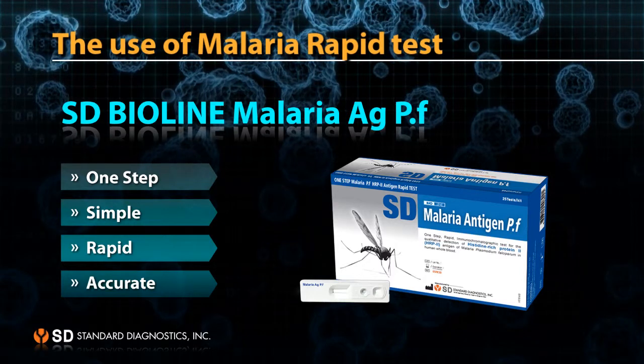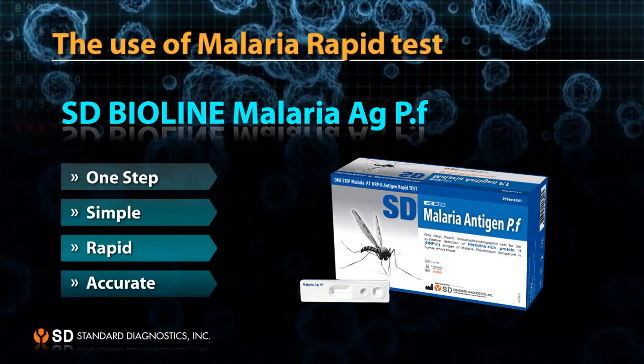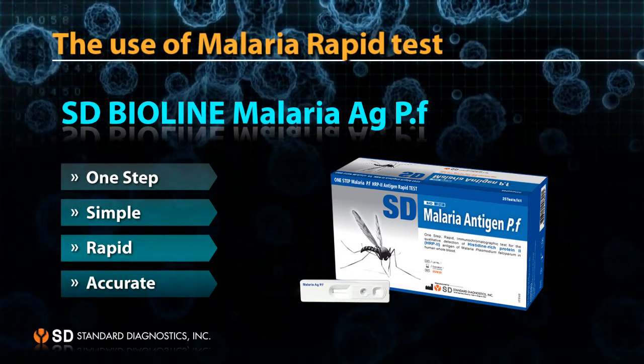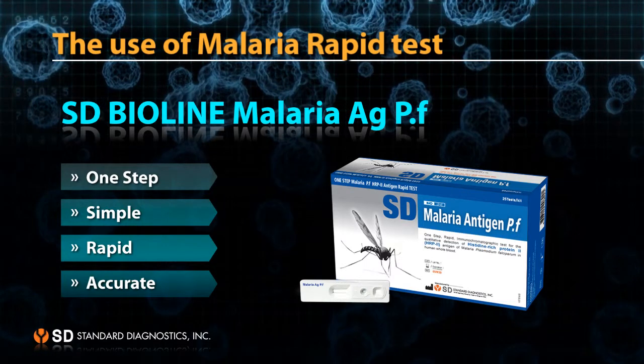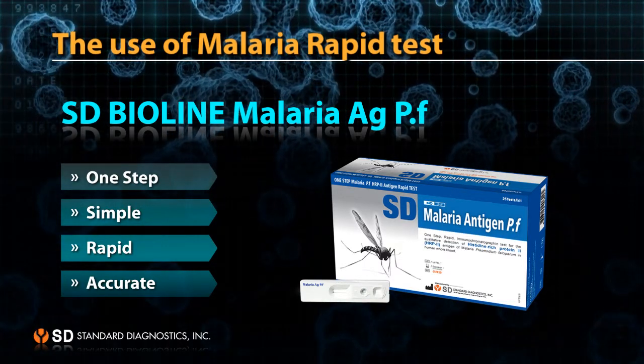Malaria Rapid Diagnostic Tests, RDTs, assist in the diagnosis of malaria by detecting evidence of malaria parasites in human blood. The Malaria Antigen PF Rapid Test is a one-step, simple, rapid and accurate test.